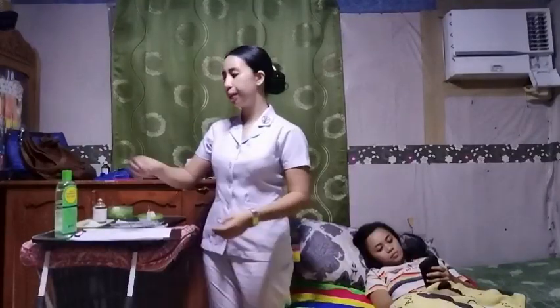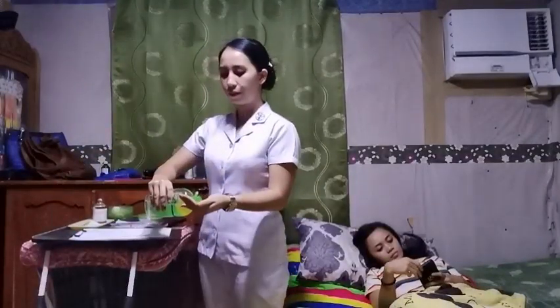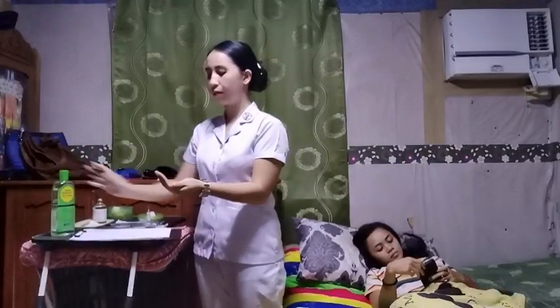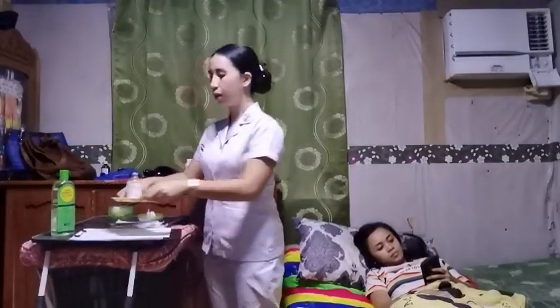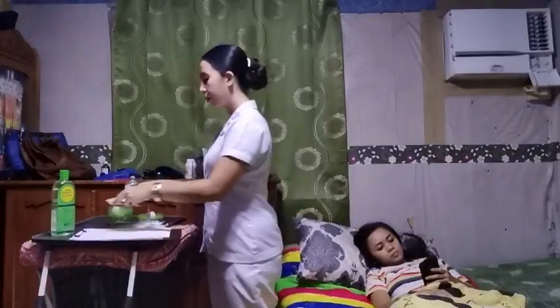Yes. And then perform hand hygiene and observe appropriate infection prevention procedures. And then arrange the medication cart on a hypodermic tray with the corresponding drug. Now determine which site will be used and expose the potential injection site.